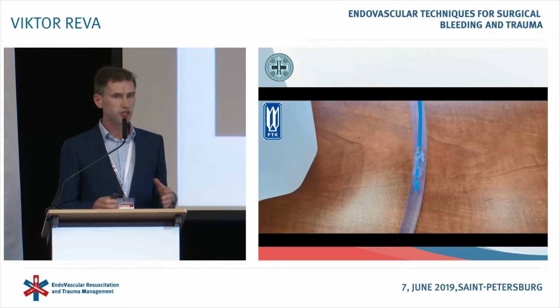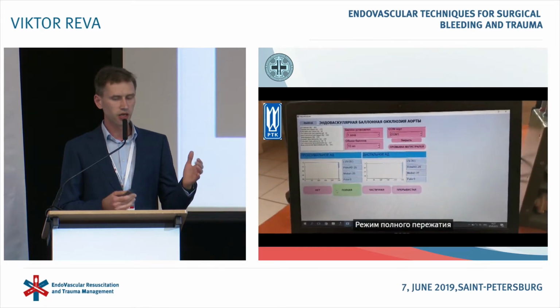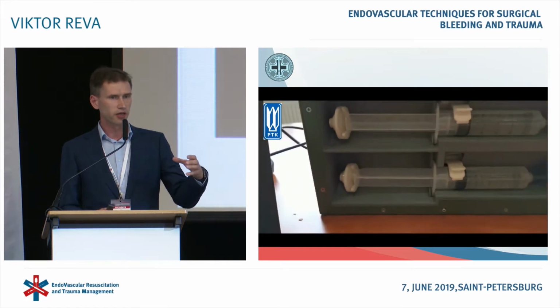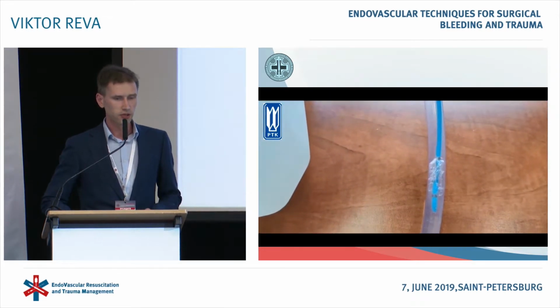Prepared by one of St. Petersburg institution. It allows to automatically control the level of aortic occlusion. It is not complete occlusion, but based on proximal and distal blood pressure, the computer, by inflating or deflating the balloon, allows to evaluate the level of perfusion.